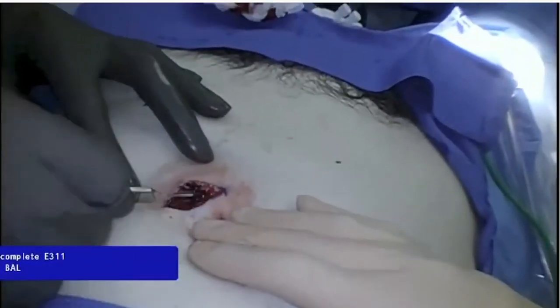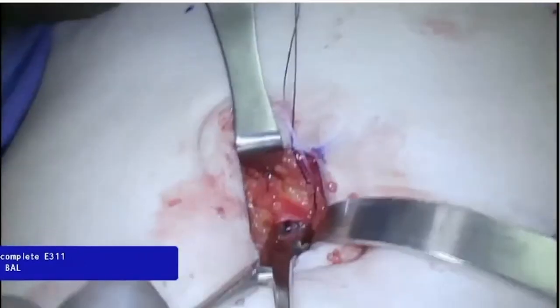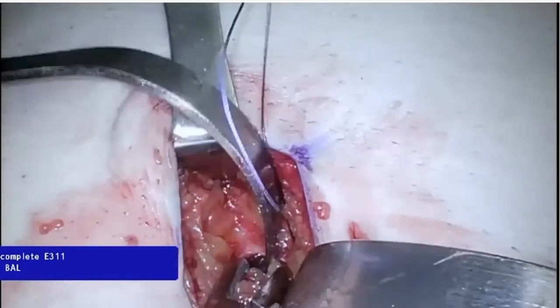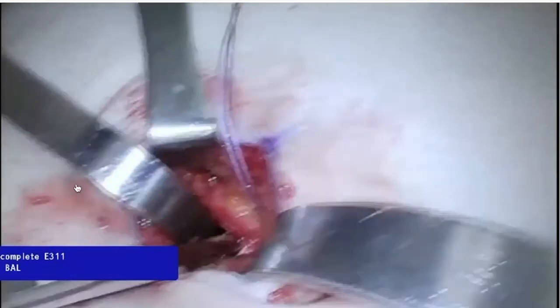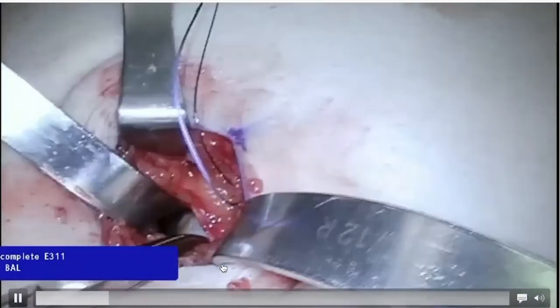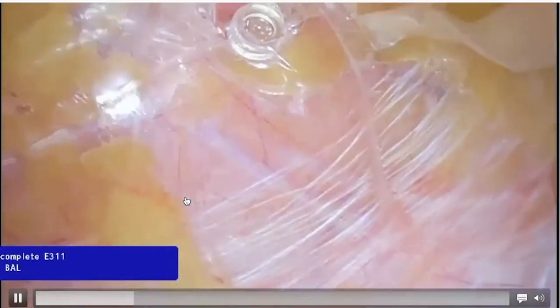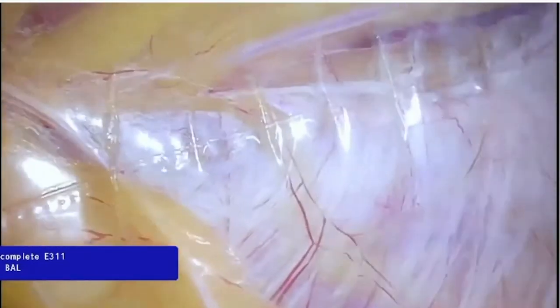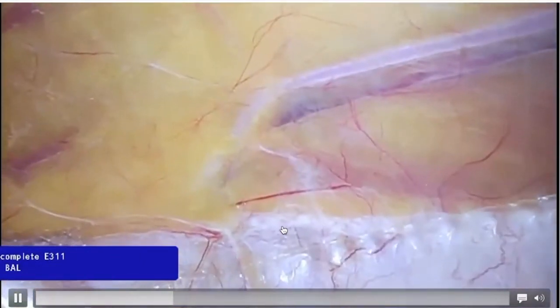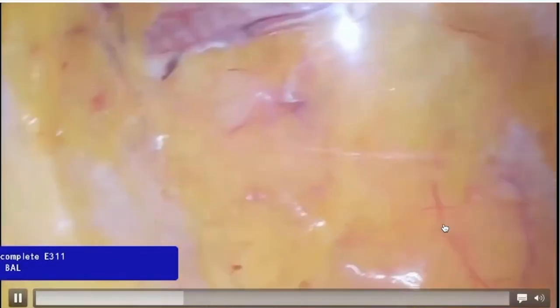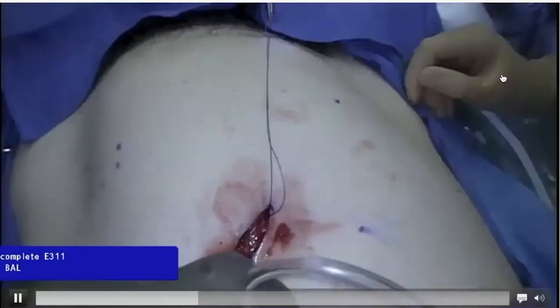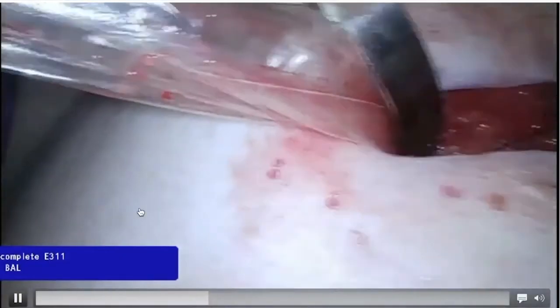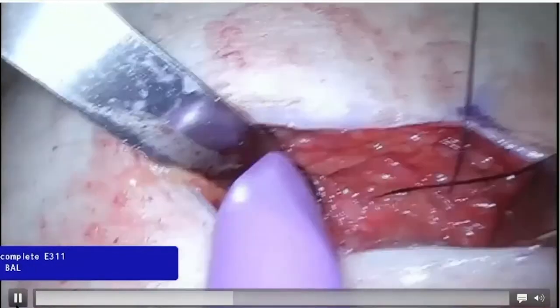This video shows accessing along the left paraumbilical area and exposing the anterior rectus sheath, pulling the muscle laterally. The balloon dilator camera is placed inside — you can see the space under direct vision. Here, the right epigastric vessels are visualized, this is the peritoneum, and the pubic symphysis is right here in the midline. At the end, an S-retractor is used to pull the dilator out, and you can see the posterior rectus sheath. This trocar is then used to help create additional space laterally.